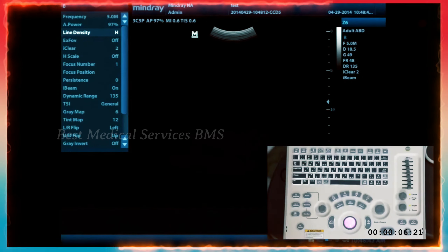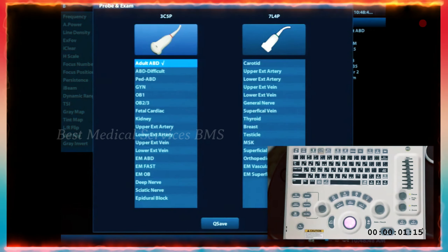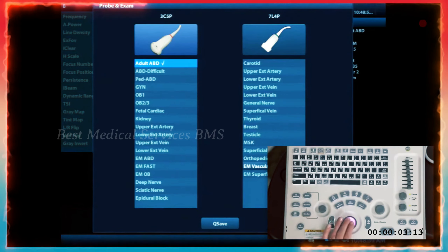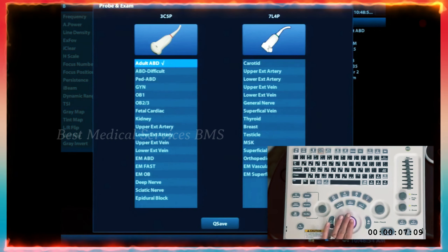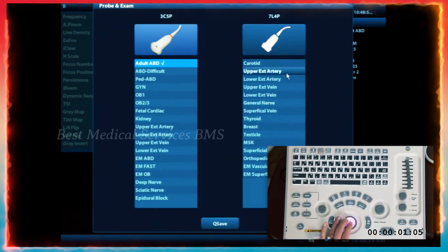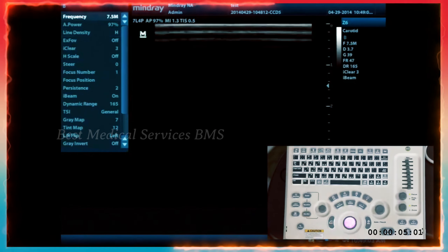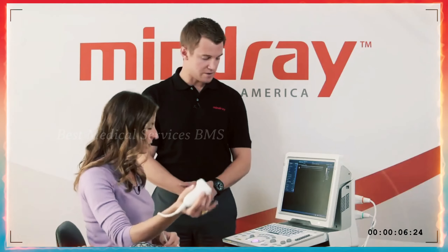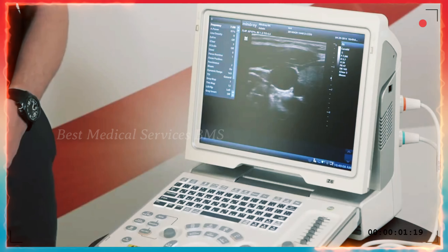Step two is selecting your probe and your exam preset at the top of the keyboard. You'll see that you have your two transducers plugged in — your curvilinear and your linear transducers — and each has exam presets listed underneath. By scrolling through and using the set key, you can pick one. The system is very responsive, switching between curved and linear very quickly.